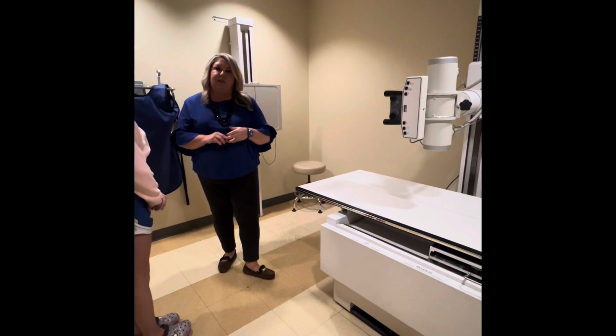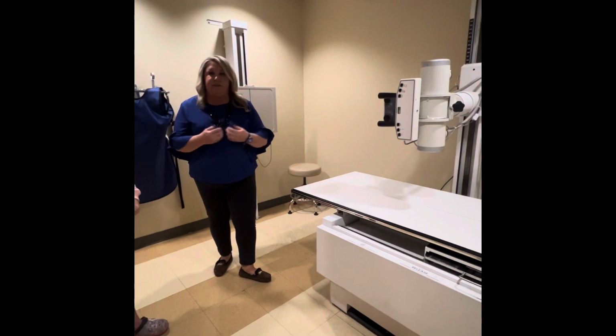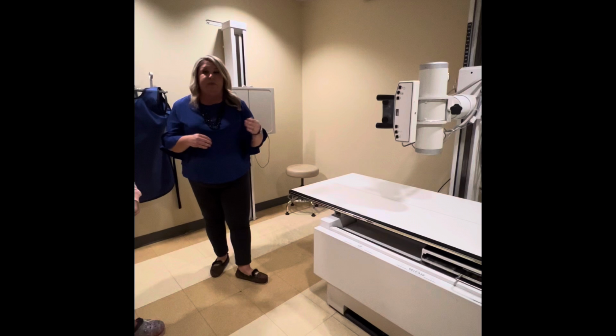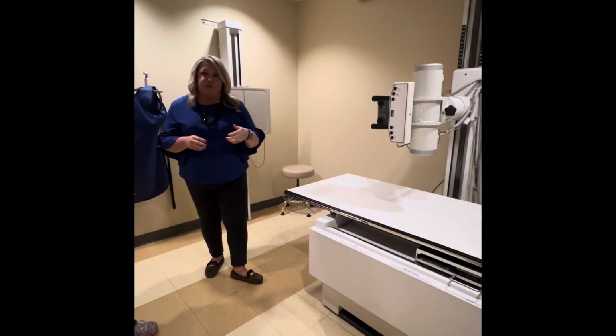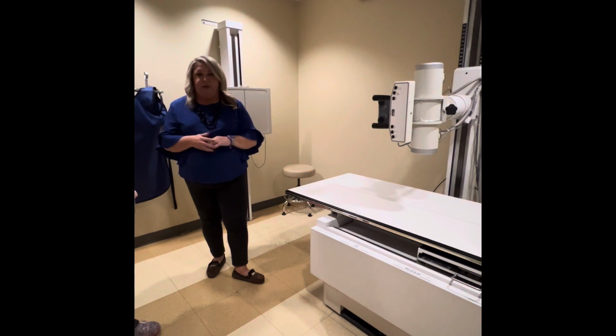We also want to make sure that we get a detailed history of what's going on, the signs and symptoms of why we're doing this chest x-ray, and any surgeries that they may have had that are relative to the area. If it's a woman within childbearing years, at most facilities, that's ages 12 to 50, we will ask the last menstrual cycle. And we can always shield for a chest x-ray, so we'll make sure that we do that as well.